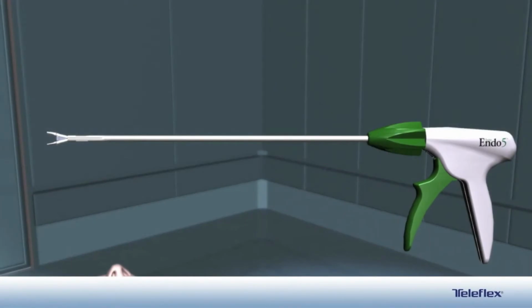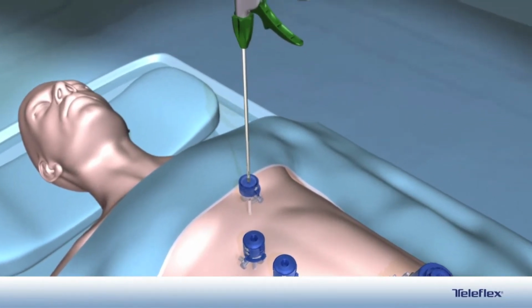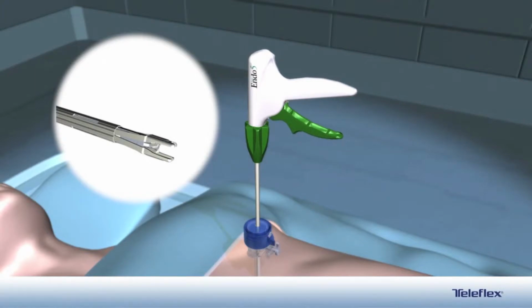A Weck Hem-o-lok auto-endo 5 mm clip applier is inserted through a 5 mm port. The handle of the applier is squeezed to load a clip into the jaws. A distinctive audible click is heard, indicating the clip is fully loaded.